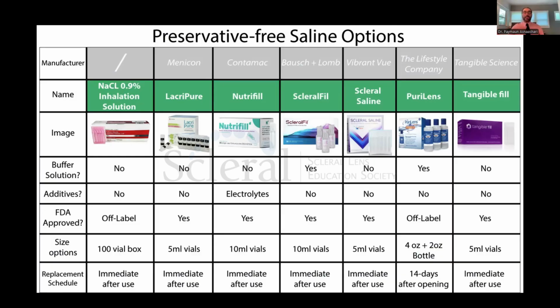So this is a very busy slide, but I actually put this together before this talk to show you at least what I've seen that's available on the market. These are all the available preservative-free saline options for scleral lenses. You're welcome to take a picture. You can also send me a message. I will put my contact information afterwards if you care to have this.